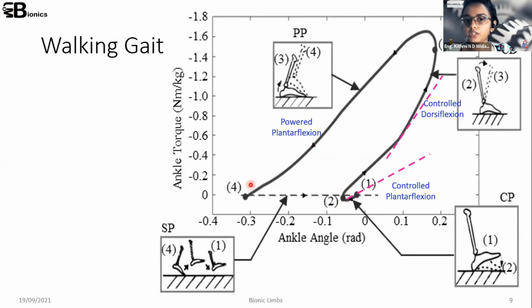I told you that we are going to power this phase using the motor, but we decided to control these 2 phases using torsional springs.